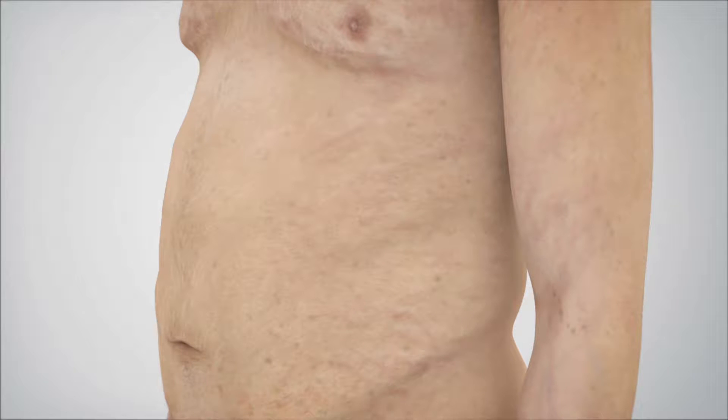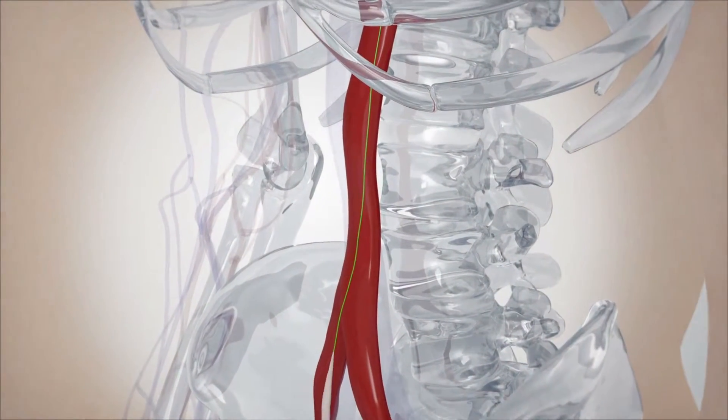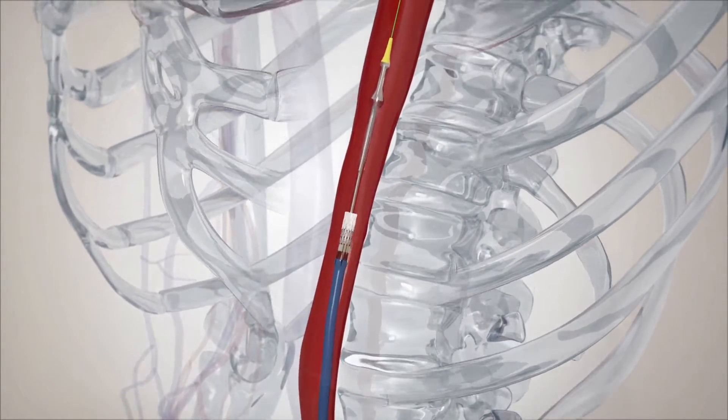This cartoon shows the femoral approach for transcatheter aortic valve implantation. The introducing sheath and dilator is inserted via the femoral artery to the descending aorta, and the dilator is withdrawn. Then the TAVI equipment is introduced.